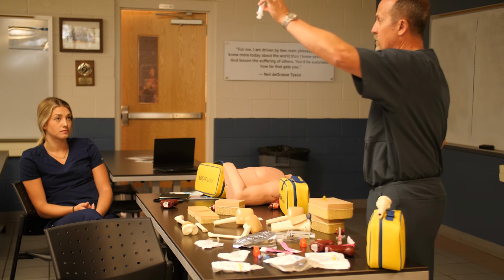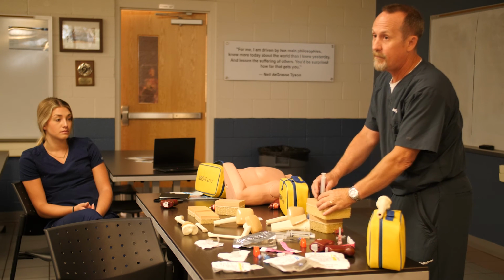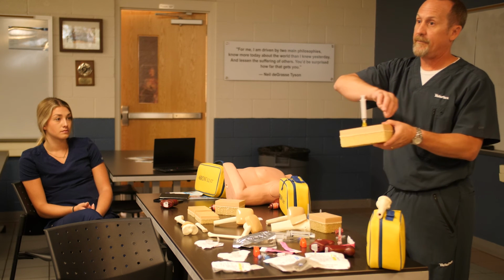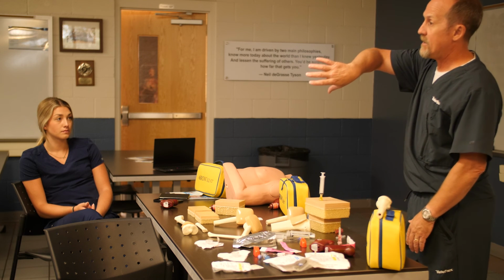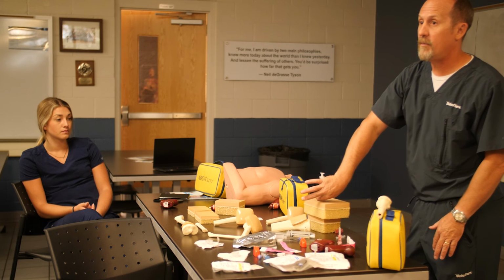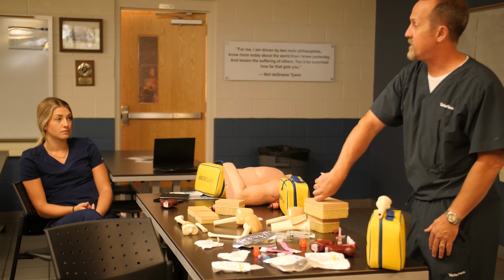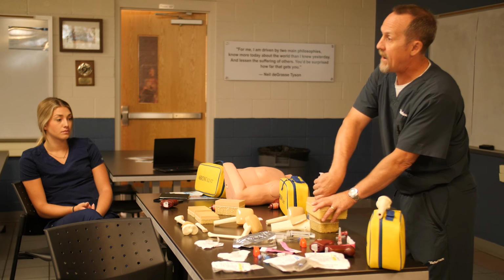We can use any Luer lock syringe that you have, attach it directly to the hub, okay? Now we've got a removal tool, right? So what I always recommend is that you turn your hand upside down like this, grab onto the hub with your finger and thumb, and then you can wrap the rest of your hand around the syringe. So now you've got a handle to extract it, right? Do not rock back and forth.